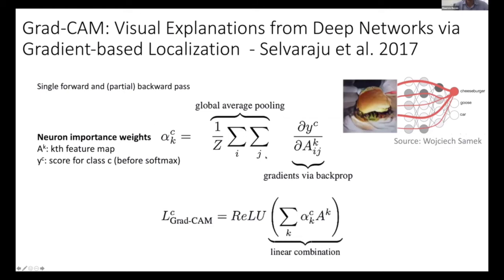Basically, all this is saying is the higher the activation, the more important that weight is. And I'm going to use that weight and combine it with the pure activation per layer. So here I have 1, 2, 3 layers. I'm going to multiply them by the corresponding weights that sum up all contributions for each layer.